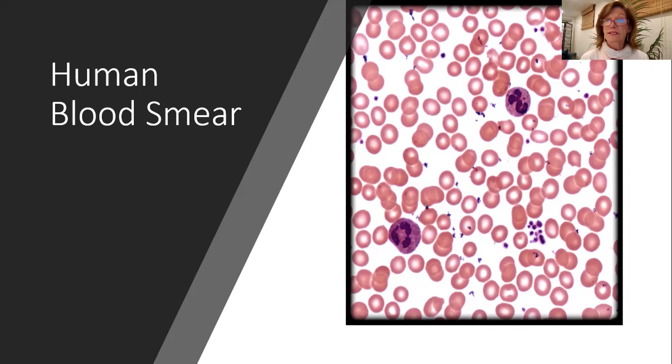You might have a nucleus with 5 or 4 segments like we see in these 2 white blood cells, or there may be just 1 or 2 segments. So we'll review that later. The other thing is the cytoplasm in the white blood cell may or may not have some granules that pick up some additional staining. Regardless of which type of white blood cell you're looking at, they always look different from the red cells, again, because they're much larger, and they have this funny shaped nucleus. So we now can distinguish the erythrocyte from the leukocyte.